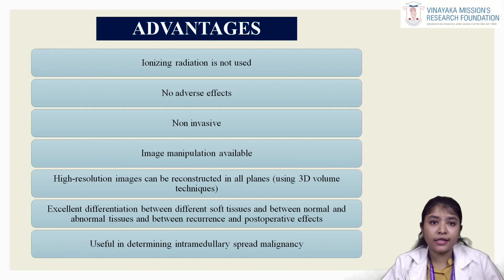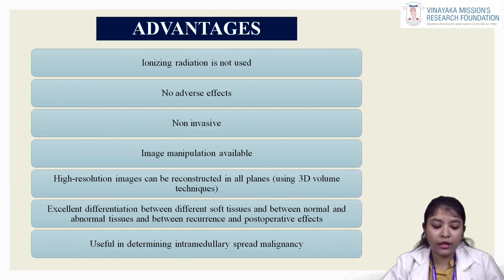So here, as I said before, MRI only uses non-ionizing radiation and no adverse effect is seen. As it does not use any ionizing radiation, exposure-related hazards are not possible. It is non-invasive, image manipulation is available, and high resolution images can be constructed in all planes using the 3D volume technique.